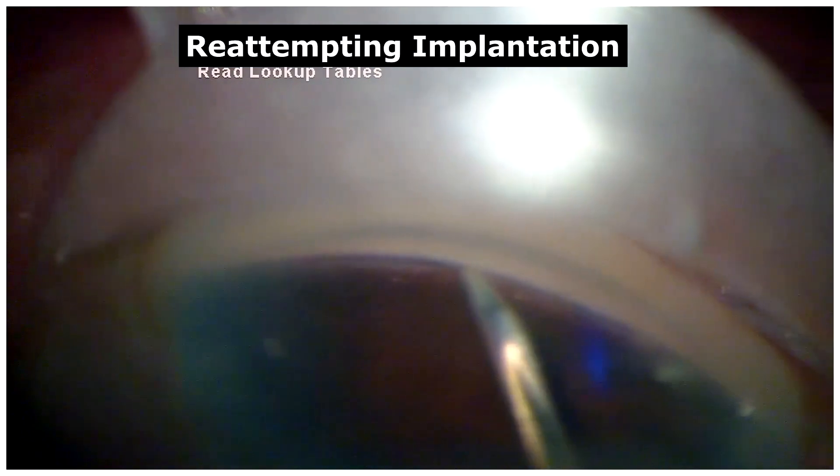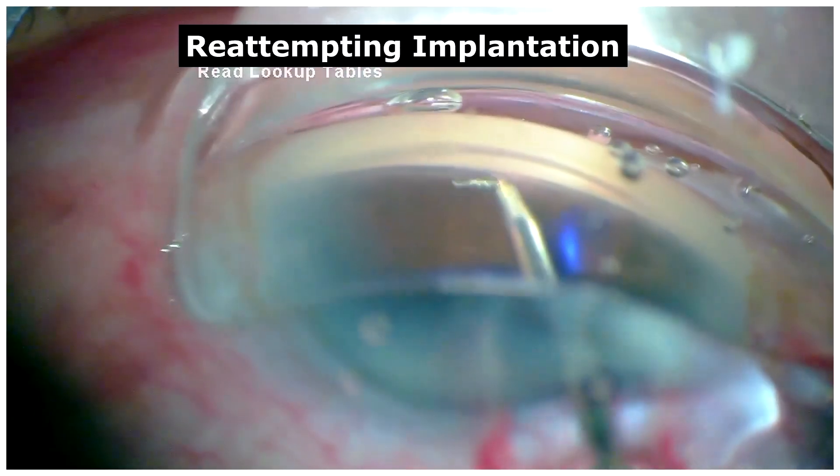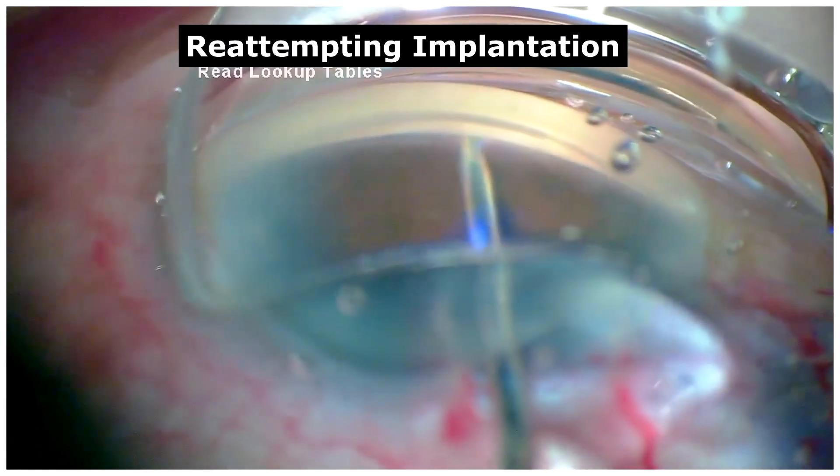So, to properly re-attempt an implantation, the iStent was retrieved using the trocar. And keeping in mind the trocar malfunctioning, the iStent needs to be released in a proper and controlled fashion as shown here.